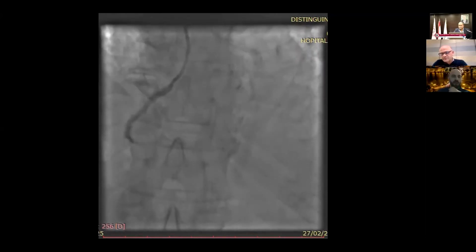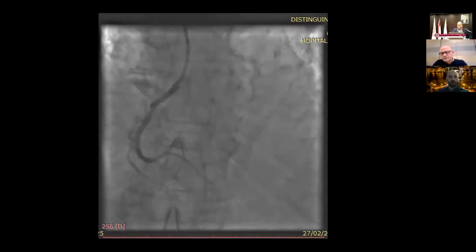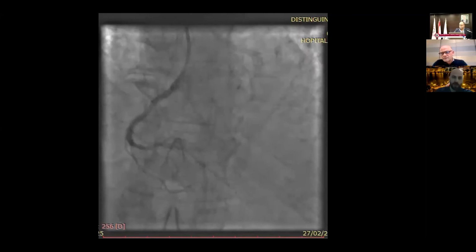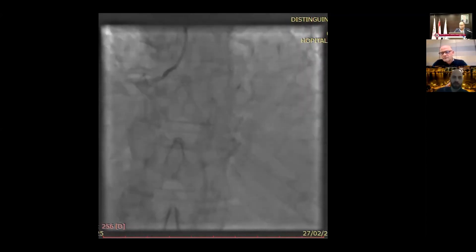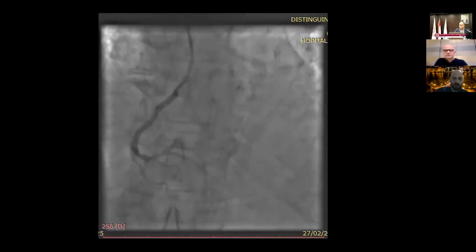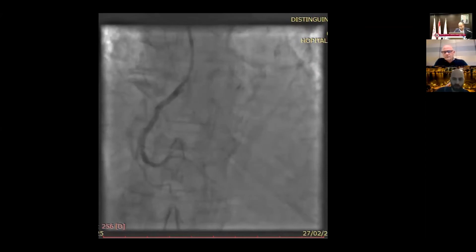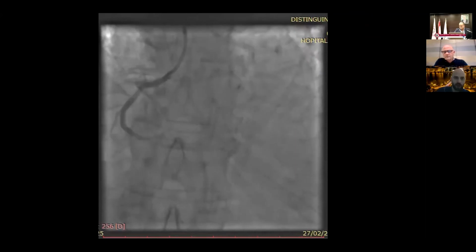I think it is, yes. If you do not have a rotational atherectomy system available, then it would definitely have been a bad idea to start this, because you would have been unable to finish your procedure, and possibly that would have cost the life of the patient in this case. Now, after fixing the culprit lesion, as an interventional cardiologist, when you see this RCA, you do not commit a failure if you do not try to fix this RCA, as with the CULPRIT-SHOCK trial.